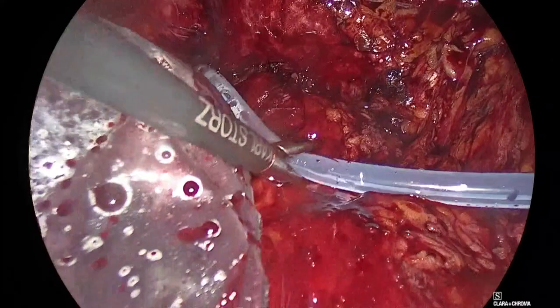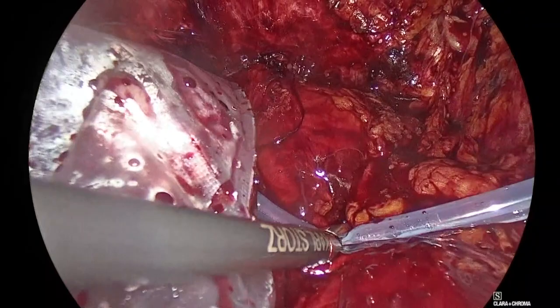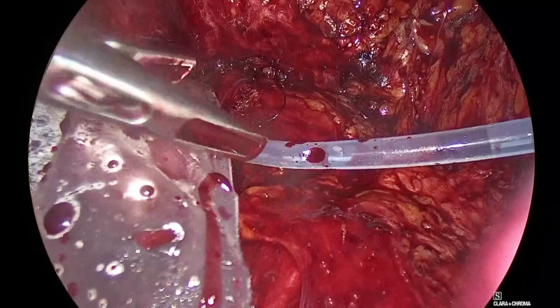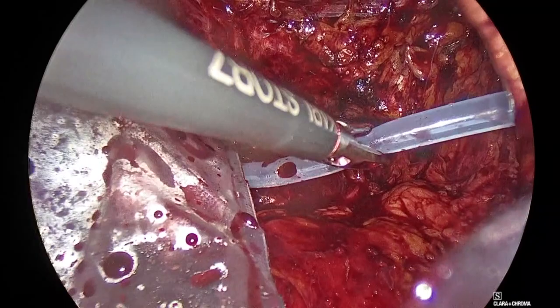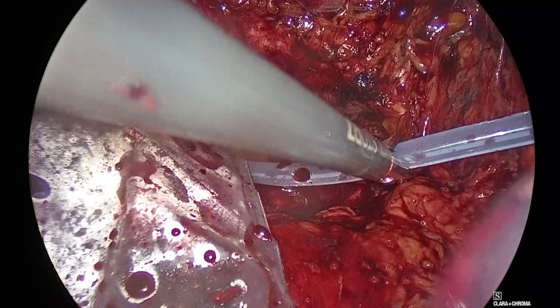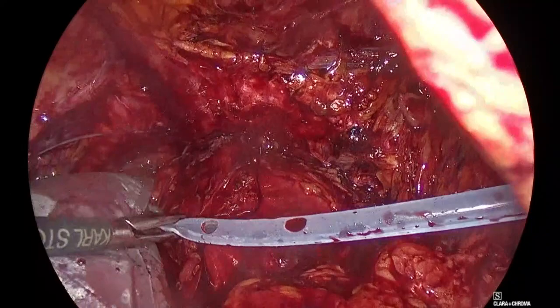I think this side is going to be... The hernia here, everything is stuck. I think it will not be a good idea. He has a hernia on the right side, so the question is whether to fix the hernia, but it's such a stuck situation here with an open bowel and open peritoneum on the right side, completely open, I will show you. So I would not do it, but it's up to you. Fix this, please.